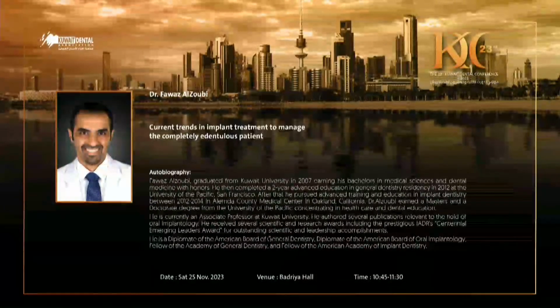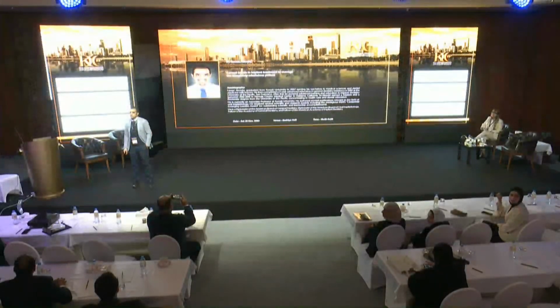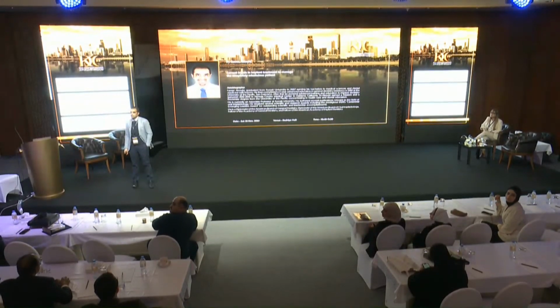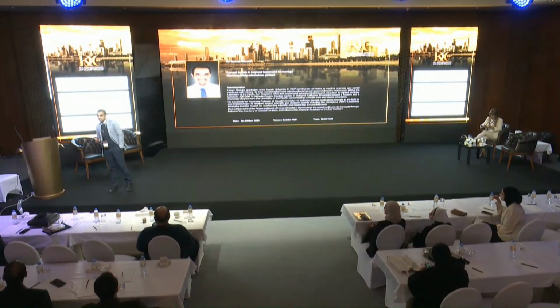Hello, doctor. Thank you so much for your lecture. I just want to ask you, are you having any problems when you're switching from a 3D printed prototype to a full zirconia or, let's say, full PEEK or whatever framework you're working with? Well, if you verify your casts, no. And digitally? Completely digitally. Like printed prototype and then switch it. Are you having any problems with the final zirconia?